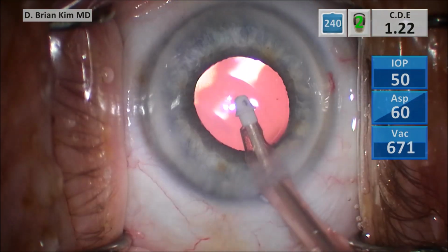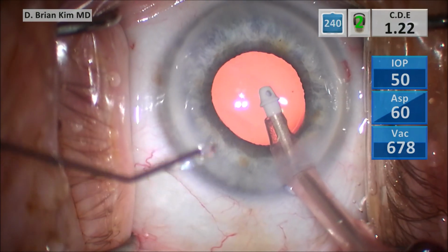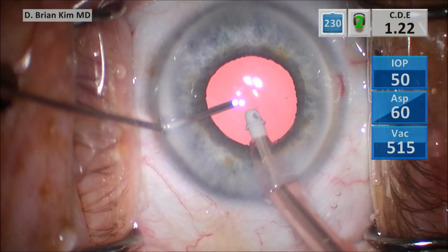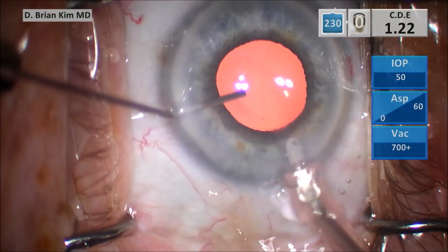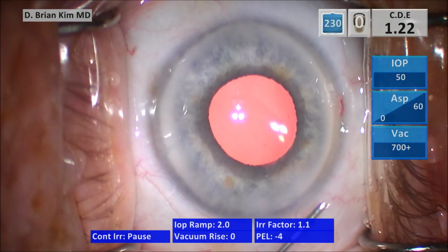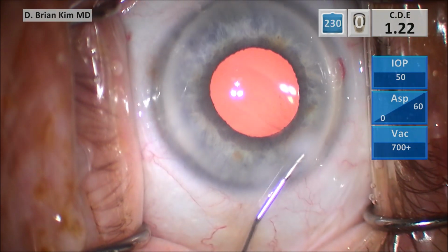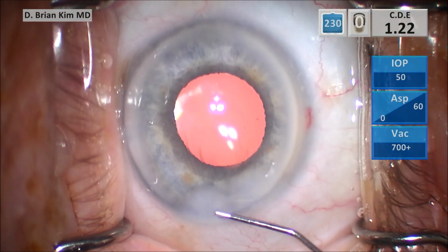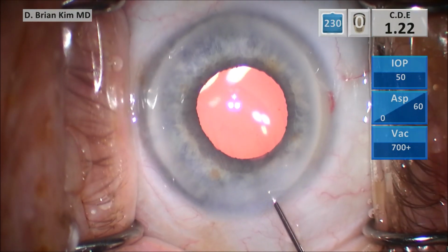So again, this is a fairly soft lens, about a 1+ density, not super soft, but enough to require some crushing forces with a double chop, cross chop. You saw this was a fairly small pupil, but not floppy really, and so I felt really confident being able to disassemble the lens with double chop, cross chop, mechanical fracturing techniques, hooking lens pieces up out of the bag.